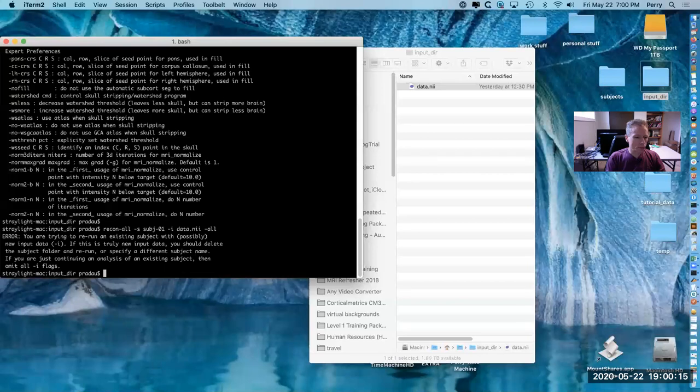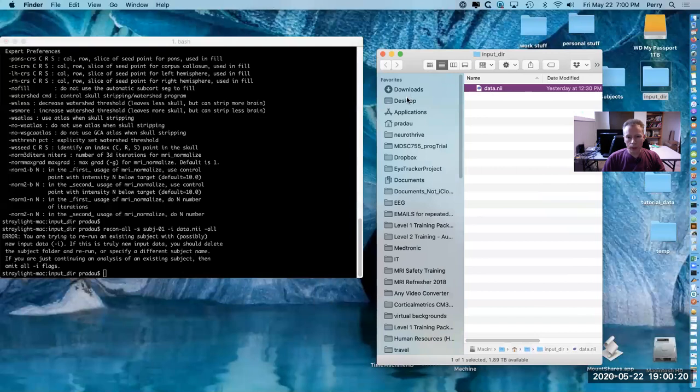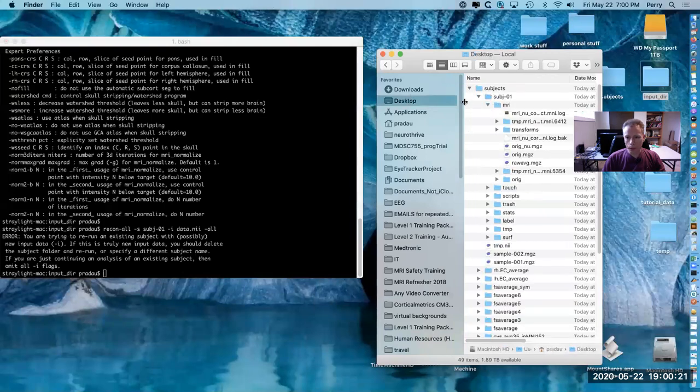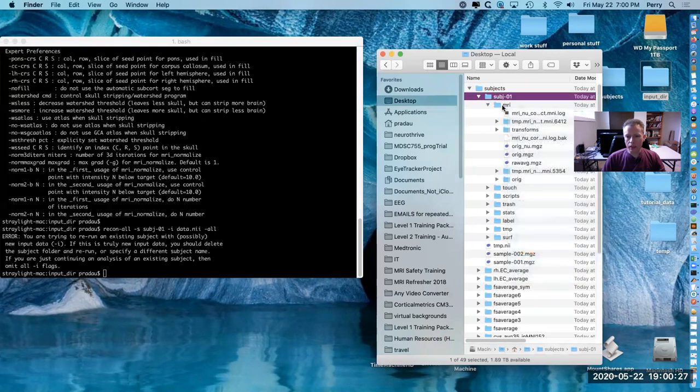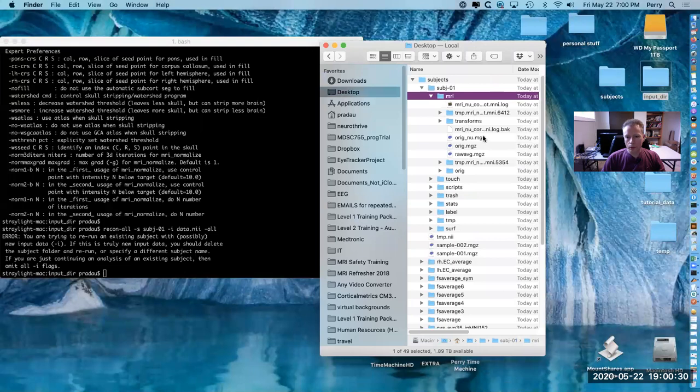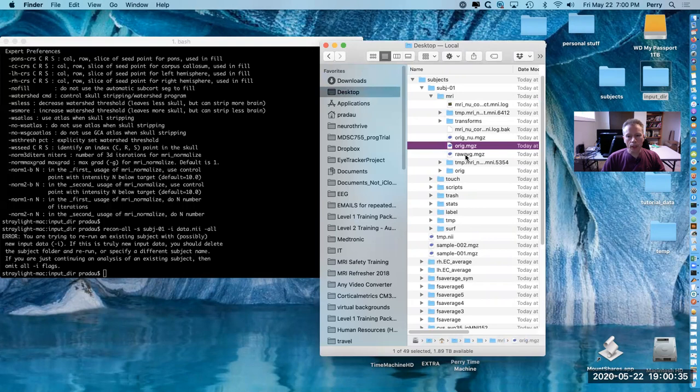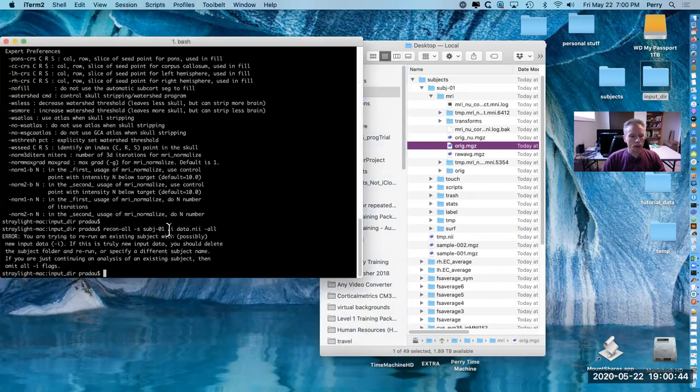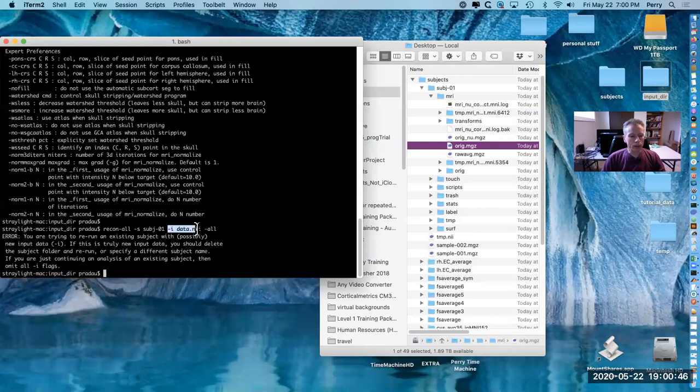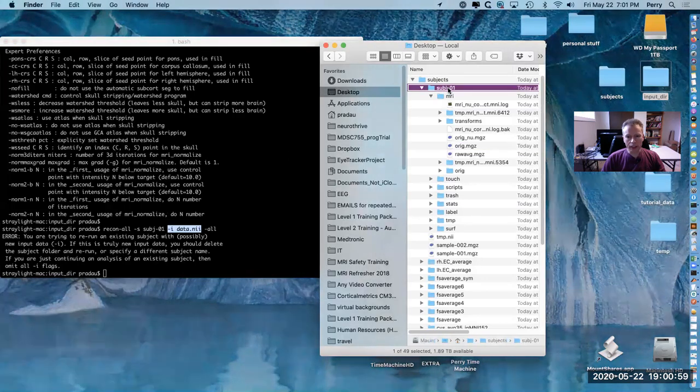Okay, so this is a typical problem. I already previously ran this and it created this directory. In this directory you can see that there are these mgz files which are equivalent to the nifty file. FreeSurfer is throwing an error because it doesn't see why you're specifying the nifty when apparently you've already created the mgz that corresponds to it, so it thinks that you must not know what you're doing. To start fresh I'll just delete this.